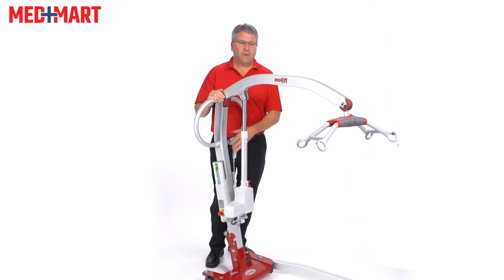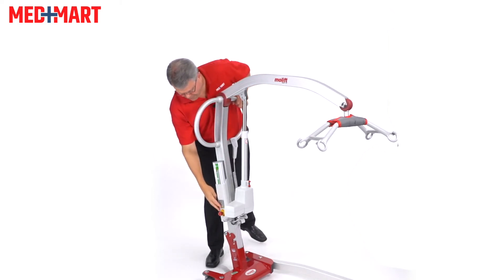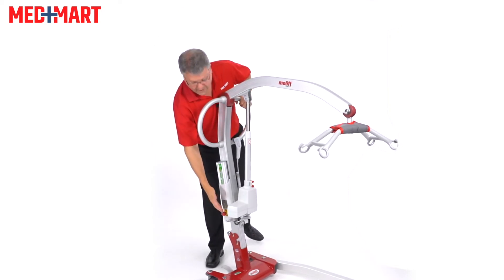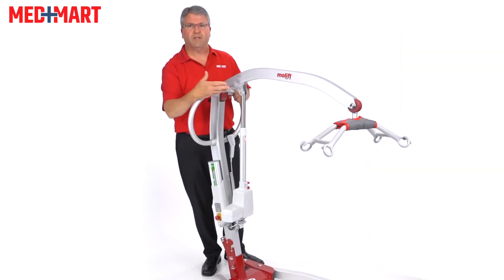In the event of an emergency where the hand control stops working or you lose power, it will lower somebody by raising this lever. If you do still have power, there's a button you can push to help bring the patient down. And there's also an emergency stop button that cuts power to the lift in case it gets stuck and continues to run.